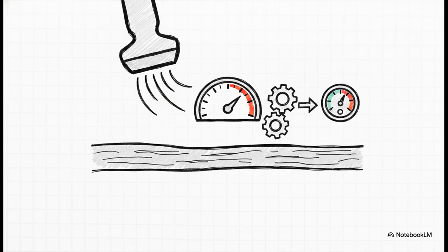Now, I cannot stress this next point enough. This is absolutely crucial. Doppler does not measure pressure. Doppler measures velocity. When you're holding that ultrasound probe, the machine is only recording how fast the blood is moving. It has literally no clue what the actual pressure inside the heart is. Zero. We have to use math to convert that speed into a pressure gradient. So remember, velocity is the real measurement we take, and the pressure, that's entirely calculated.